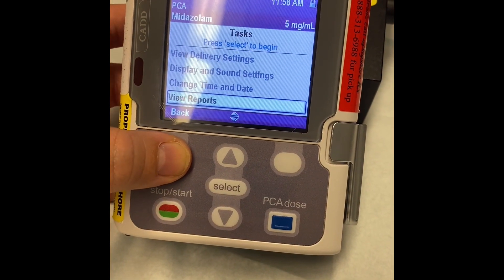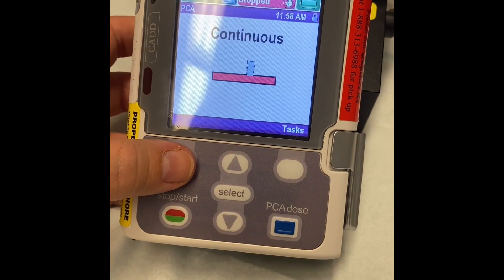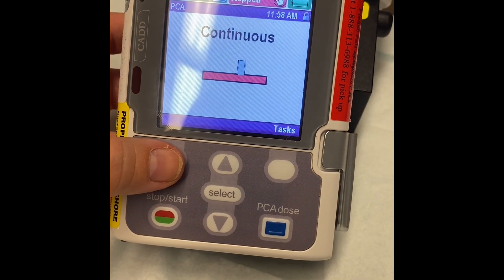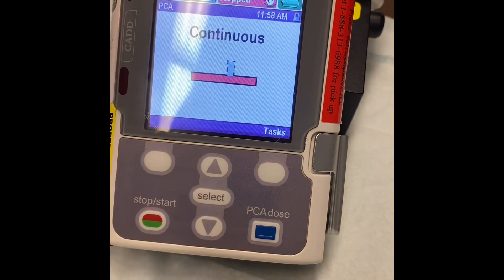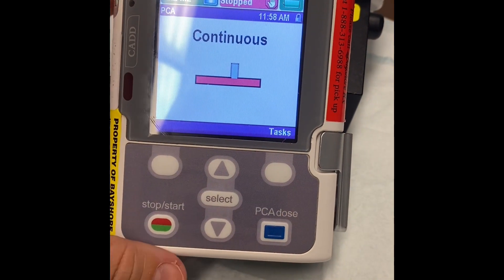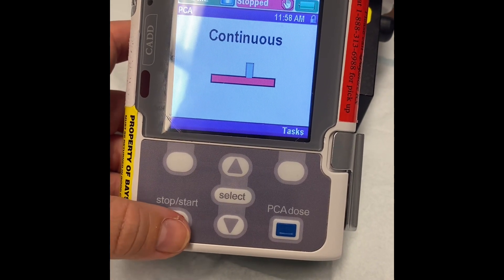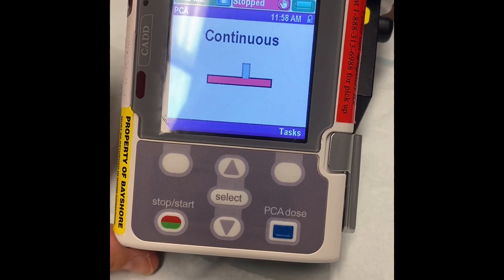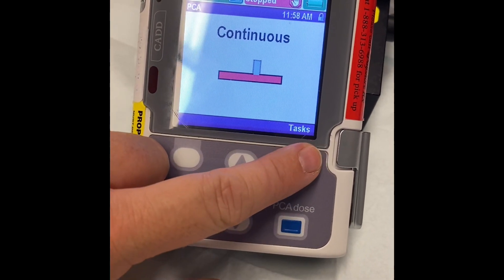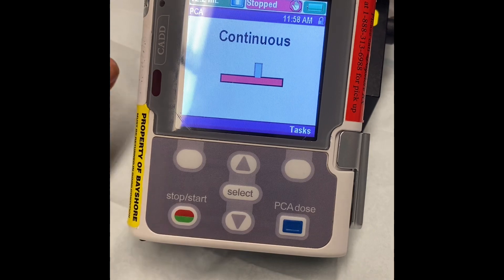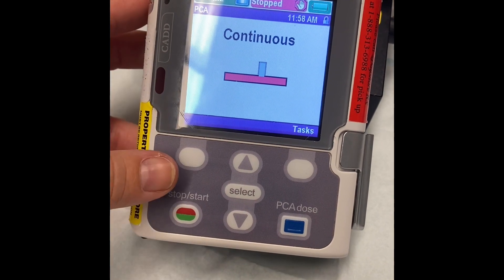Go back to your main screen and you can see what we were looking at before — this is a continuous infusion, this is how much is left in the bag, and it's not currently running, it is stopped. In order to start it again, if you had to stop it for some reason, you can press stop/start. But you do not need to stop the pump in order to go through these tasks with your nurse colleague. They are co-signing with you.